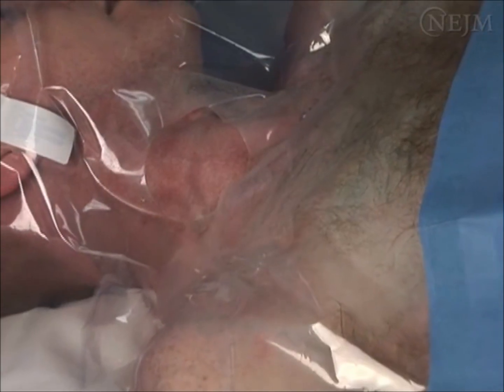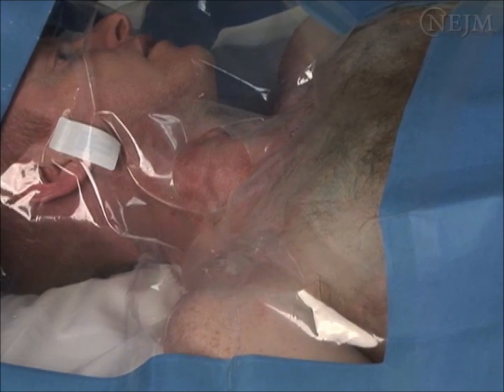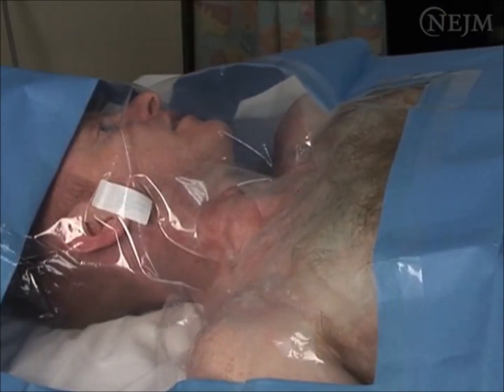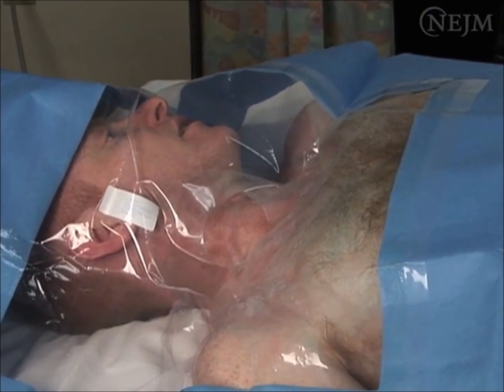Be sure to include all landmarks within the sterile field. If the patient is conscious, explain that his or her face will be covered, but that breathing will not be obstructed, and that he or she can signal for attention by raising his or her hand.